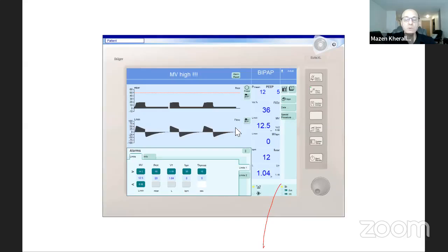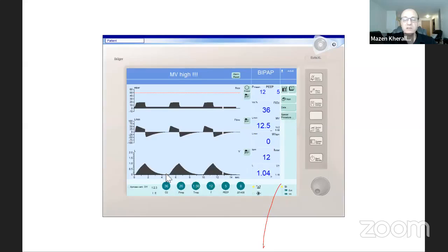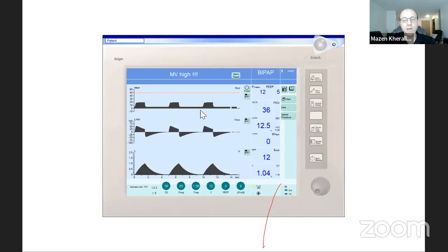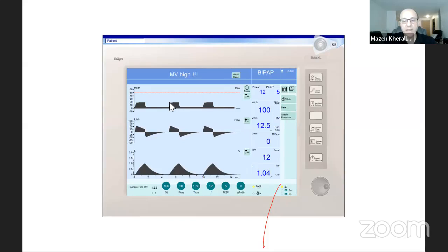Now we're going to understand how to set APRV. I'm going to start from pressure control ventilation. You can see the breaths are similar to each other — this patient is not breathing on his own, breaths are triggered by time, rate is 12. Every five seconds there is a breath. Once started, the machine gives an inspiratory pressure of 20 cmH₂O, which stays for 1.5 seconds, and then we have expiration.